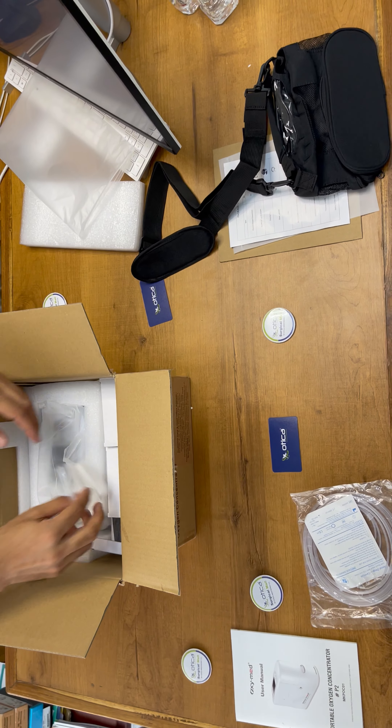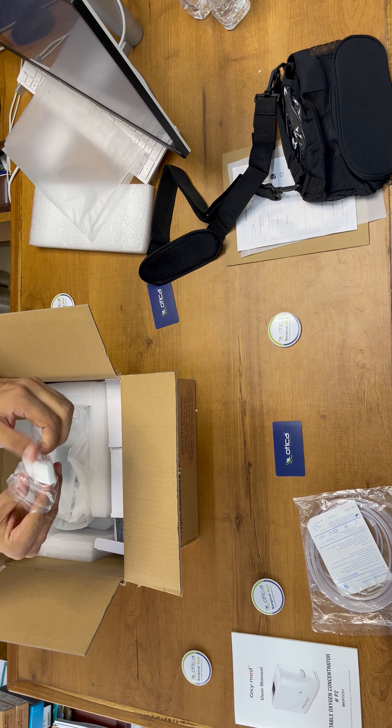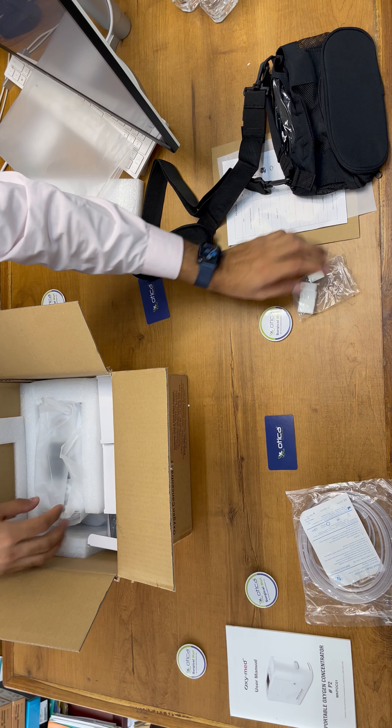Now we are going to look at the filter set. The company is providing five additional filters along with the machine. This is the filter — you need to replace it whenever required.